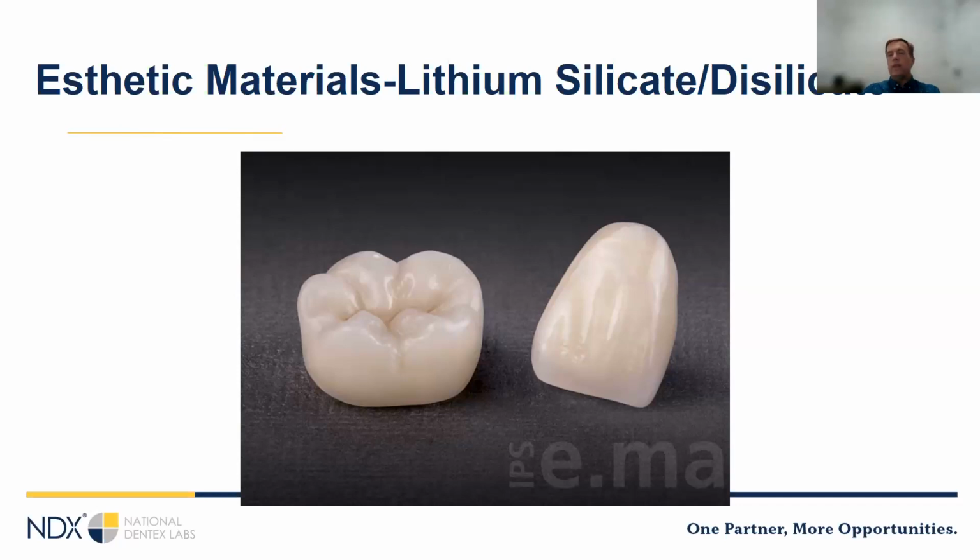If you're doing a veneer next to a bridge case, I would say a lithium silicate or disilicate veneer next to a layered zirconia bridge gets a nice aesthetic result. You can make up to a 3-unit bridge into the premolar area with Emax if the biomechanical situation allows. But sometimes you could overload those bridges.